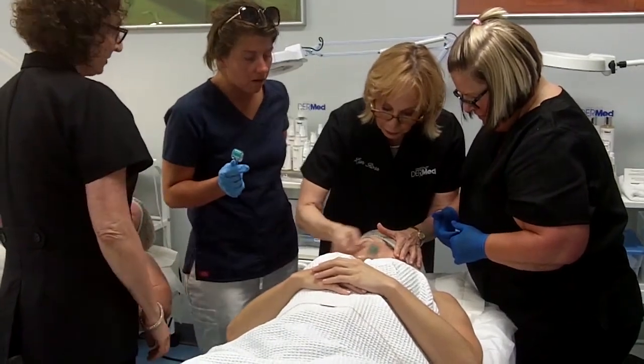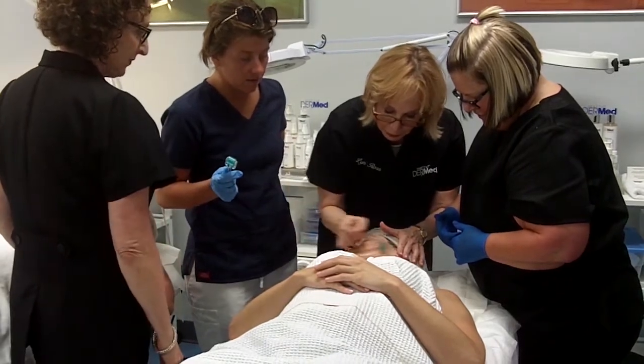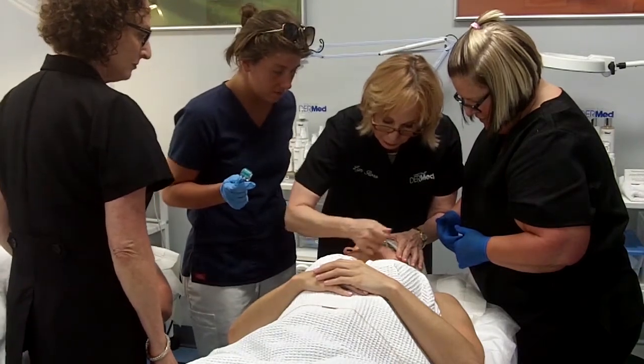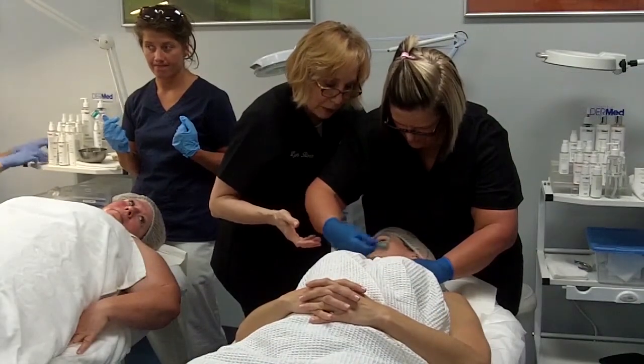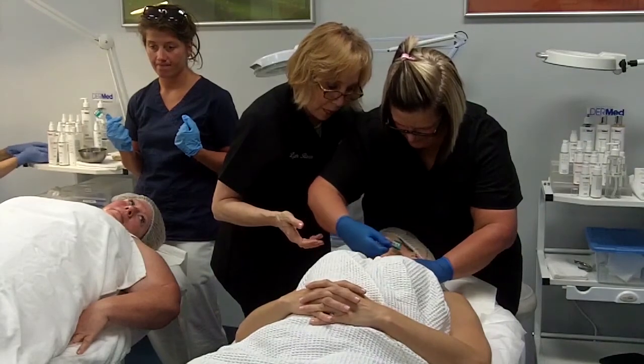Look at how much you want. 1, 2, 3, 4, 5, 6. That's just me counting so that I'll know how many passes I've made. You've got more to your left. There's a little bit down here as well.